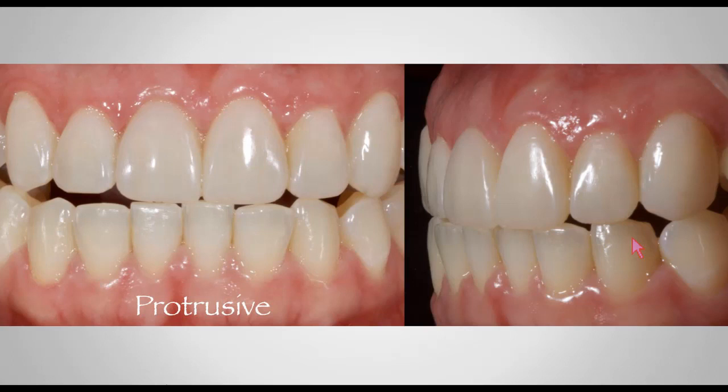They can fracture something. I'll show you one case where there was a fracture, and they're very easy to repair. Normally when they fracture on me, it's because I overlooked a little spot when I was doing the occlusal adjustment, and I'll show you a case exactly where I did that.